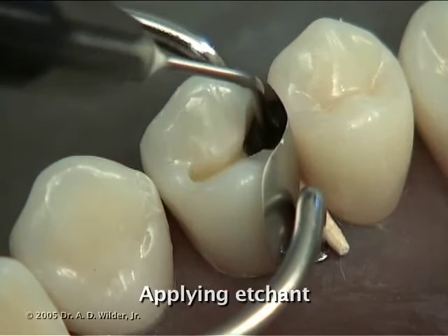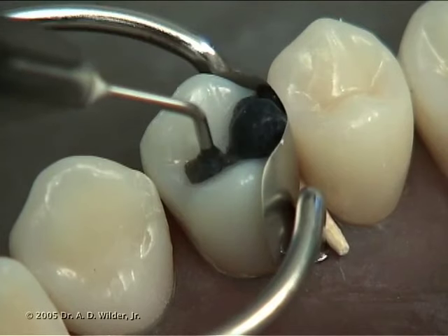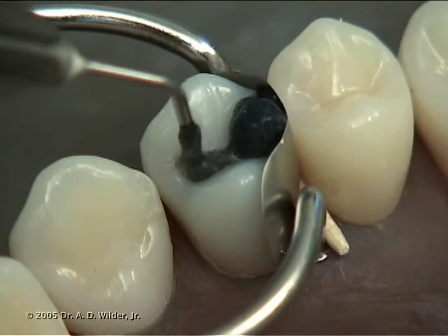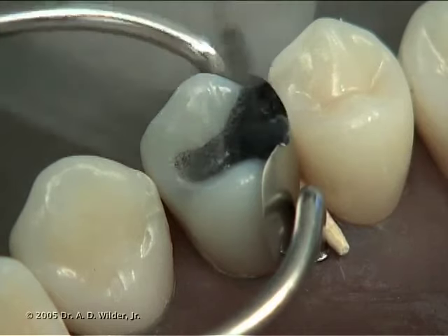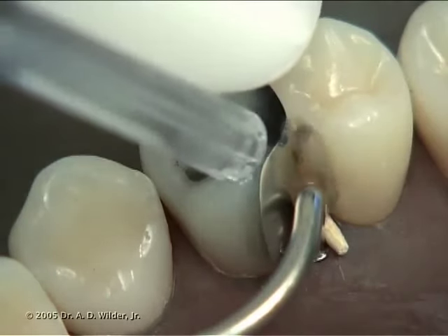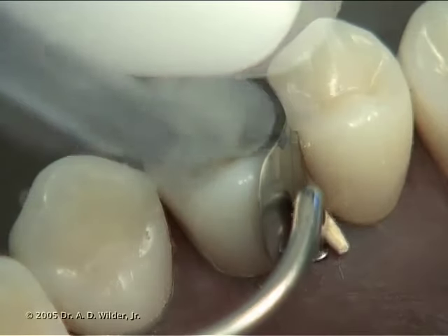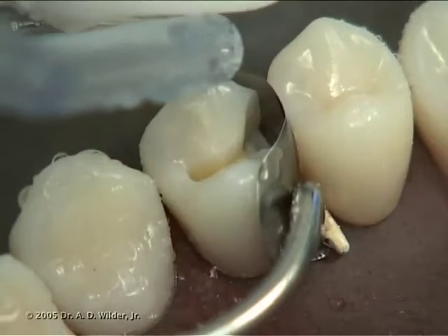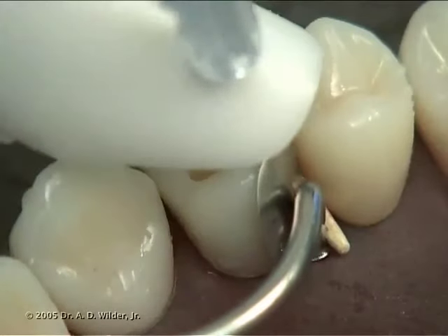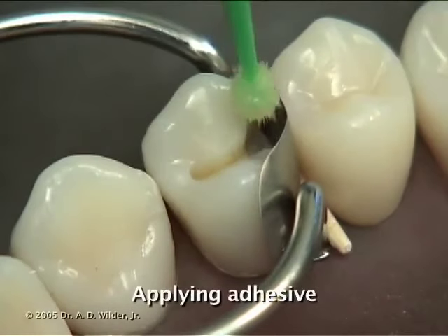Apply 30 to 40% phosphoric acid etch to the entire preparation to clean off surface debris and remove the smear layer of dentin. Let it sit for about 15 to 20 seconds, and then wash it off thoroughly with water and high volume suction, rinsing for about 10 seconds. You can gently dry the tooth, but leave it somewhat moist so you don't collapse the dentin collagen fibrils.